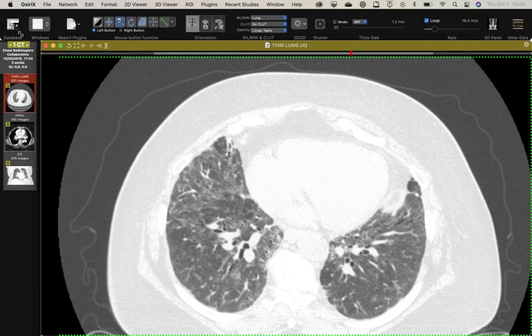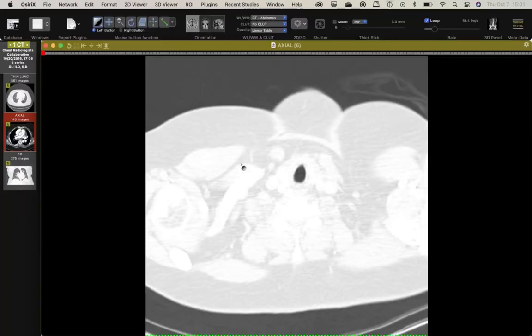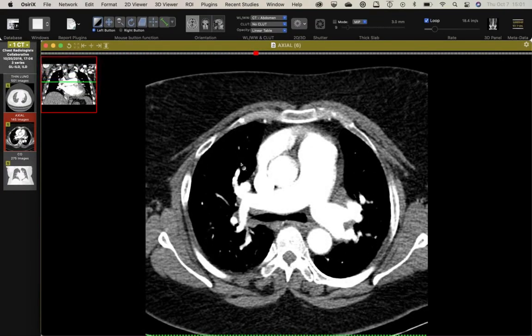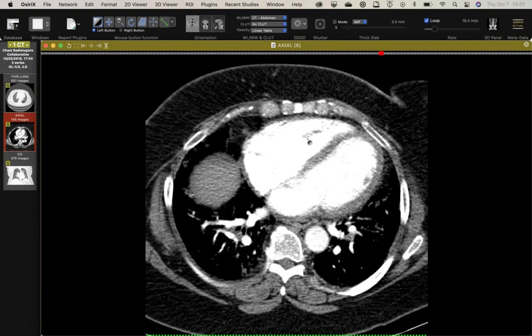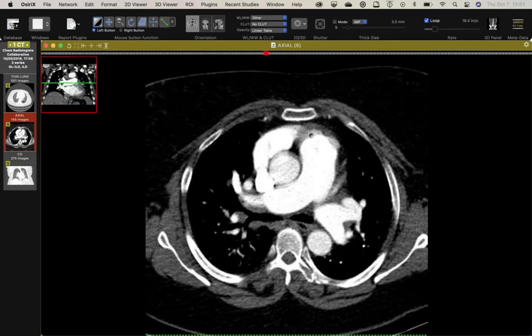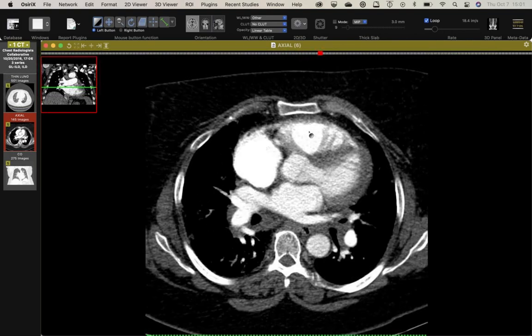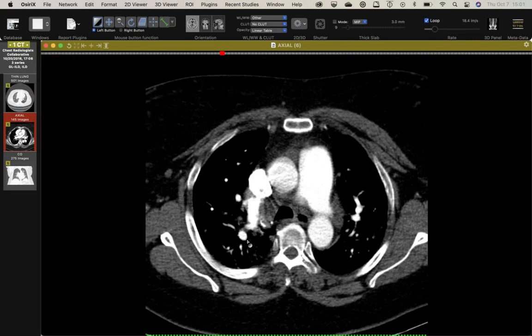So anyway, it was just kind of an odd case. Is there some kind of causal association between pulmonary arterial hypertension and GLILD and CVID, or does he have that for another reason? Not that I'm aware of. It wasn't horrible pulmonary hypertension. The RV doesn't look terribly angry, but the central PAs are quite large, and even the peripheral PAs are a little bit big. Unless there's an underlying connective tissue disease that hadn't been recognized, but I seriously doubt that, given that it would be too many different things.